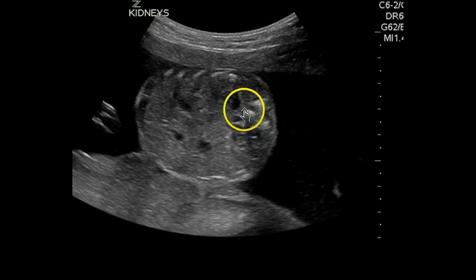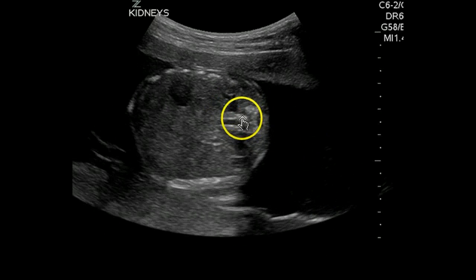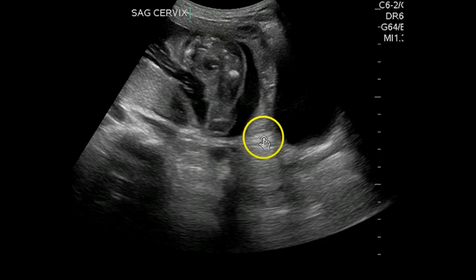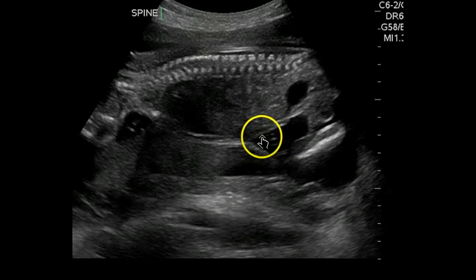So here we're seeing a little bit of pelviectasis. We're going to measure it, only measuring 3.3. Less than 4 is okay at this age. All right, great. She's gone back to the cervix. Now the lower uterine segment contraction is gone. We see the cervix. She's going to call that the tip of the placenta, and we're going to believe her. And we're going to move on from there.